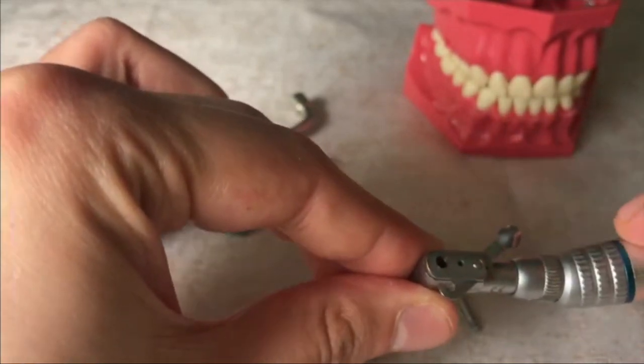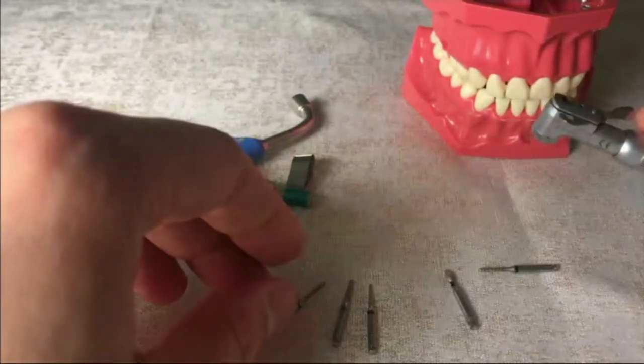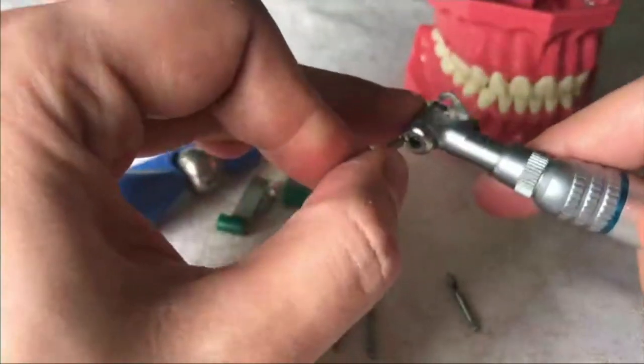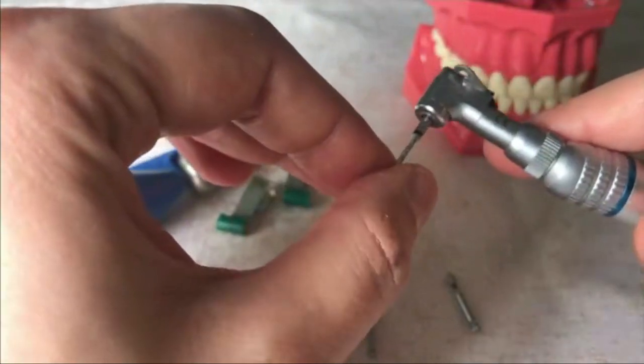On the screen, you can see how to insert and remove your burrs from your angled right hand pieces with a lock mechanism. Some of your angled right hand pieces may have a push button. You simply insert the burrs by holding down the push button on the back.